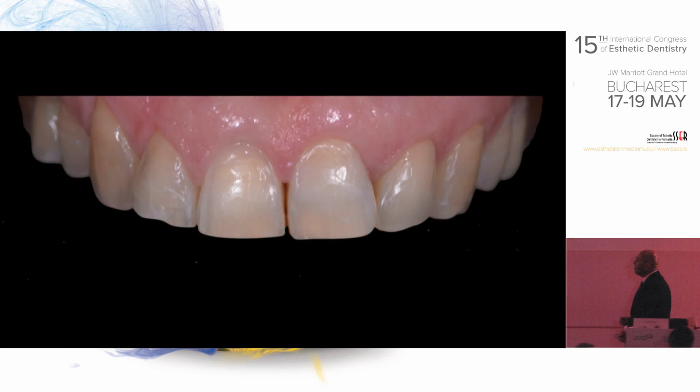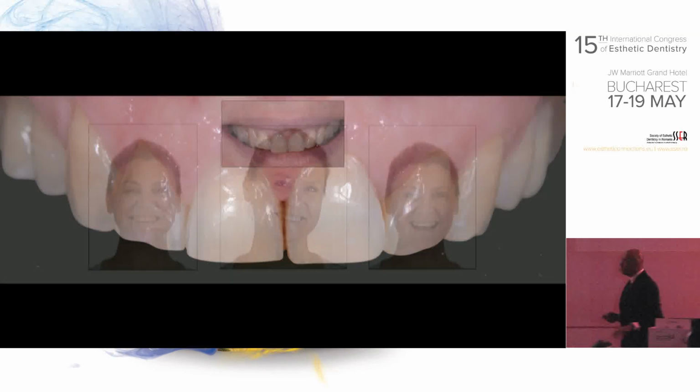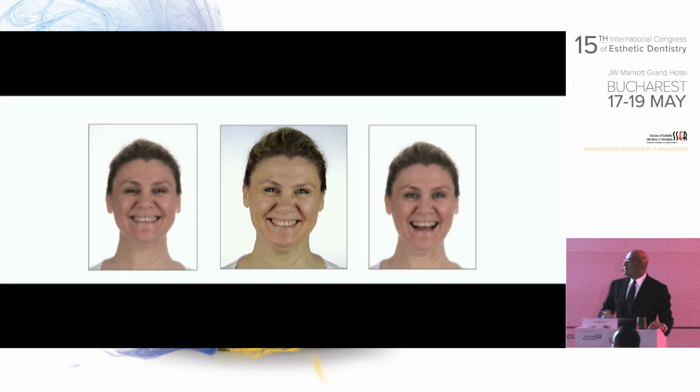Now, let me walk you through a few cases to briefly explain how this works in my last 20 minutes. So this is the patient who wants the whitest teeth ever, okay, who resisted having ortho, not okay, and I forced her to get ortho, then she accepted. So this is how we started with a small, I don't know, probably 8 months of Invisalign treatment. Now the teeth are aligned properly, and this is the smile we want to convert.